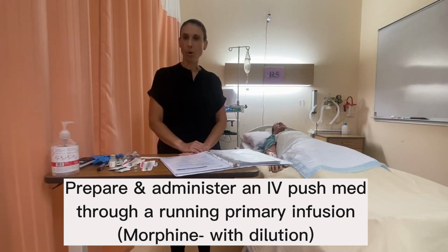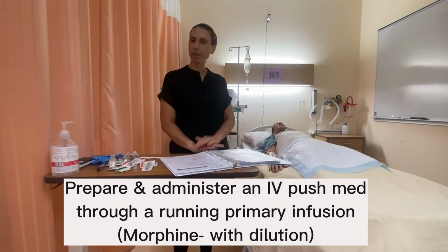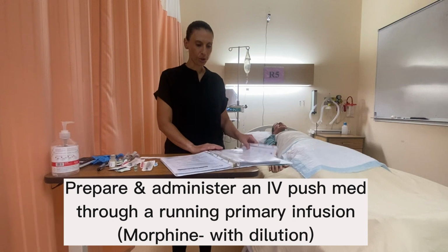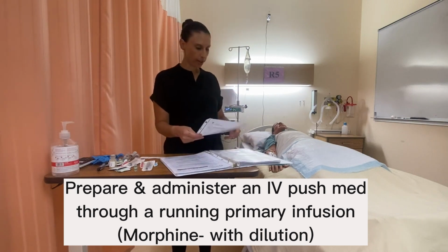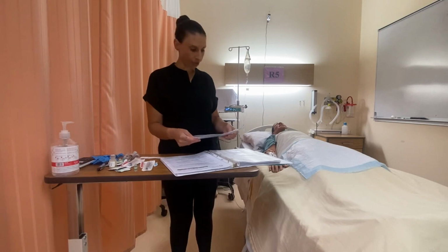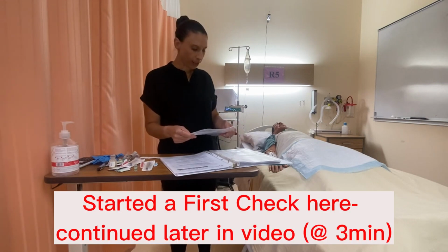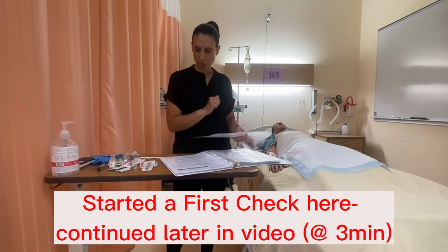This video will go over how to make an IV push medication and also how to deliver an IV push medication through a running IV. So first off, we would want to obtain our MAR and make sure that we have an order for the medication. Also making sure that it is due at this correct time, has not been given yet, and that we have the right patient, and check the dosages as well.